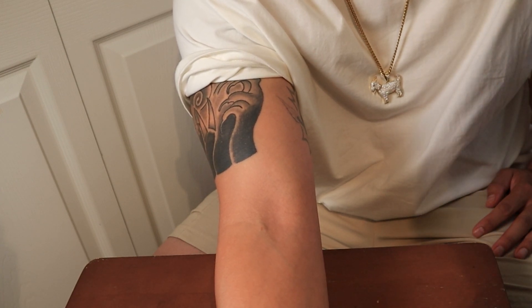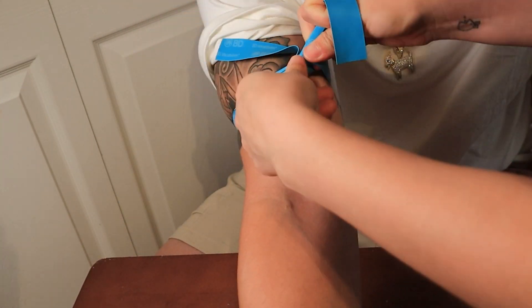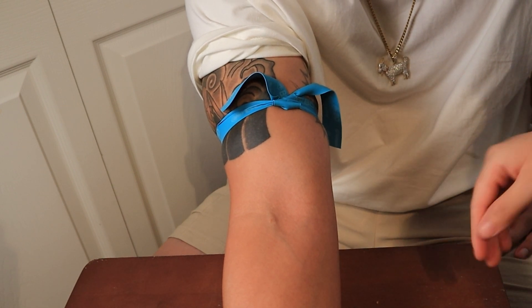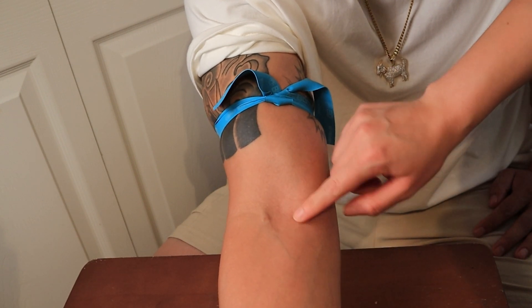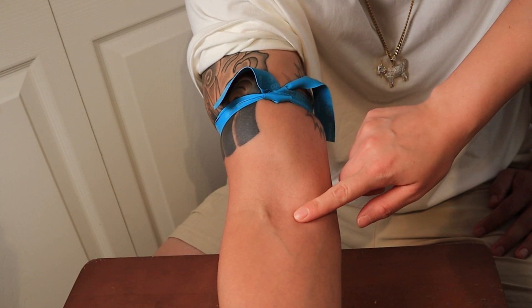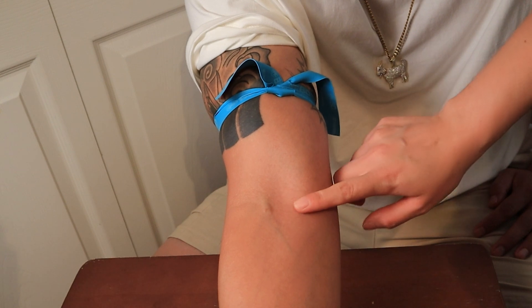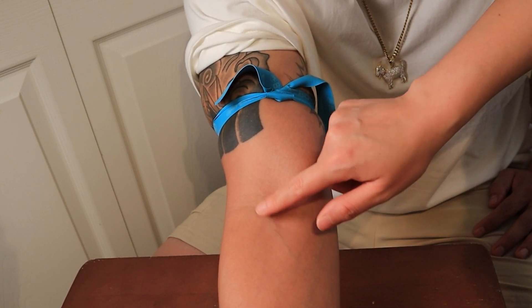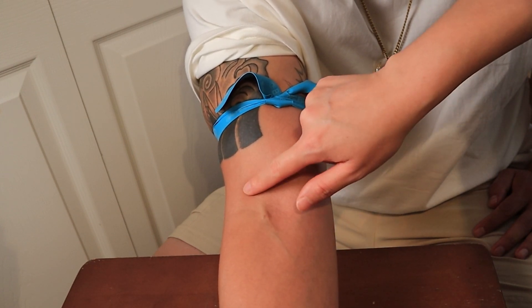First thing you do, put the tourniquet on the arm and take a look. Feel with your finger — the vein should feel bouncy. You should be able to feel it even if you don't see it. After some time, you learn what a vein feels like.